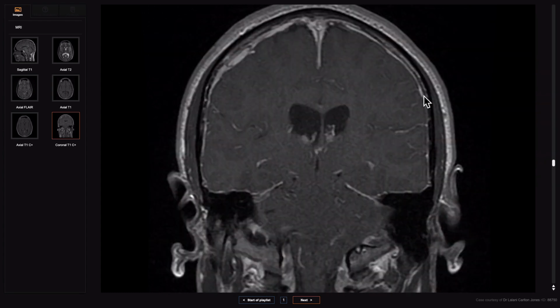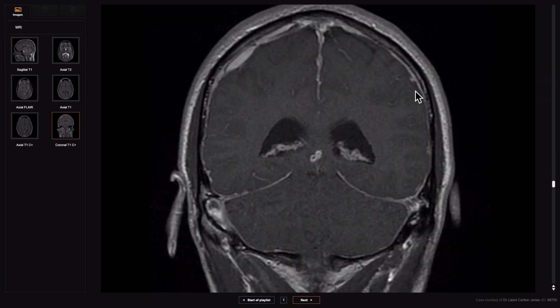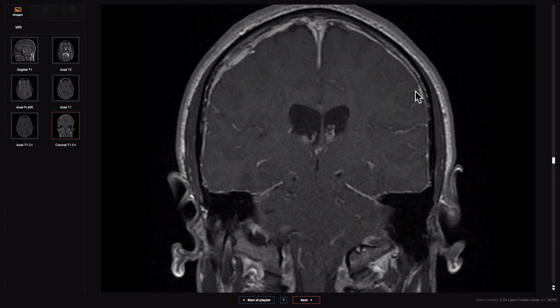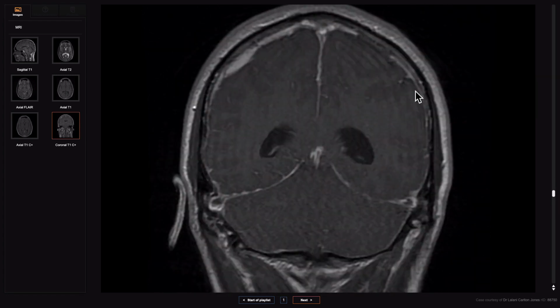Infiltrative or neoplastic causes would be expected to be more irregular, patchy, discontiguous. And that finding is due to venous hyperemia of those pachymeningeal structures and is seen in a large majority of SIH patients, usually around three quarters of patients, particularly at presentation.